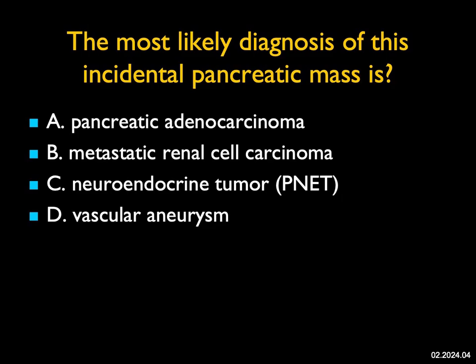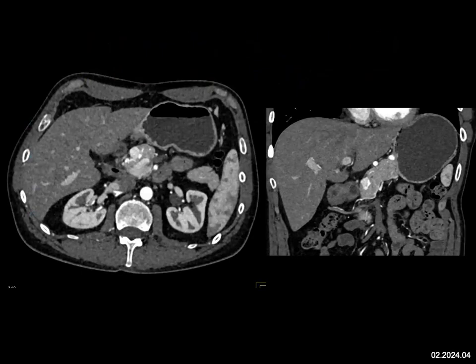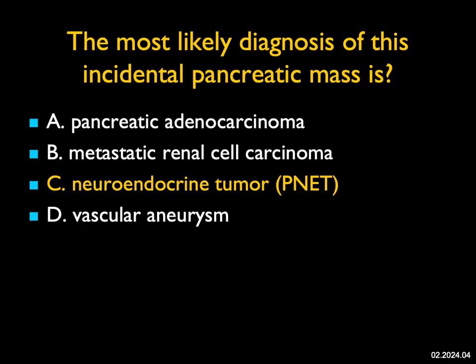The most likely diagnosis of this incidental pancreatic mass — we very nicely see on both the axial and coronal views approximately a 15 millimeter hypervascular lesion in the head of the pancreas. If the patient had a renal cell carcinoma resected, you could consider metastatic renal cell carcinoma, but the kidneys look good. It's not an aneurysm — you can get aneurysms in the GDA region simulating a pancreatic mass, but I don't see any feeding vessels. Adenocarcinomas are hypo, not hypervascular. This is the classic appearance of a neuroendocrine tumor of the pancreas.